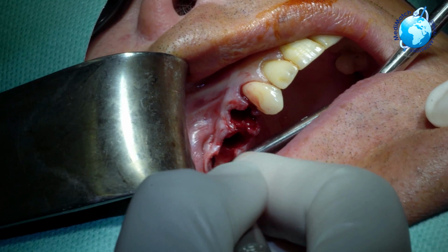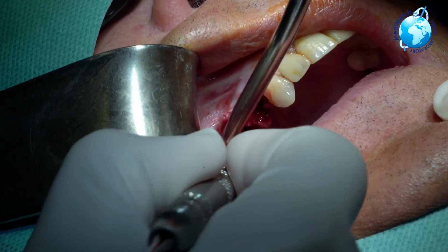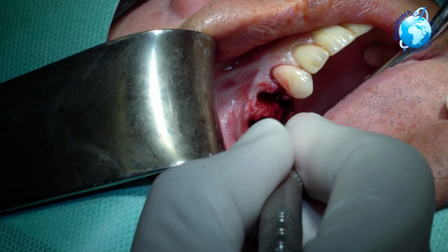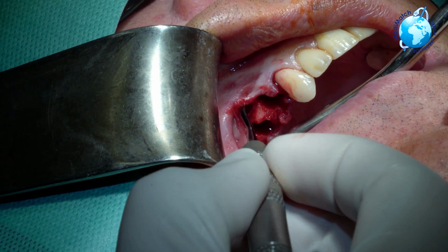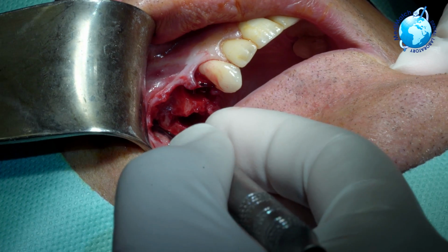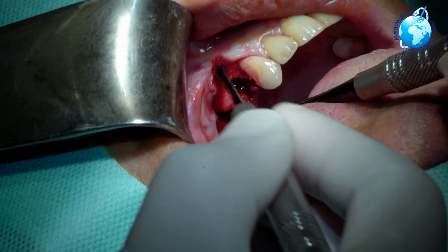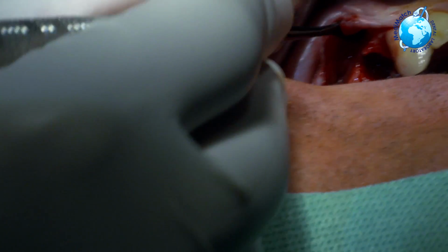A bit of pressure, Alan, and expose that bone, exposing the palatal side quite simply that way, so I have a good overall view of that bone. And we have a little bit of an infection on the front there. Now, I don't generally like relieving anteriorly too much.